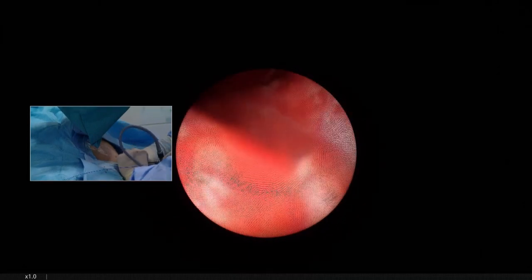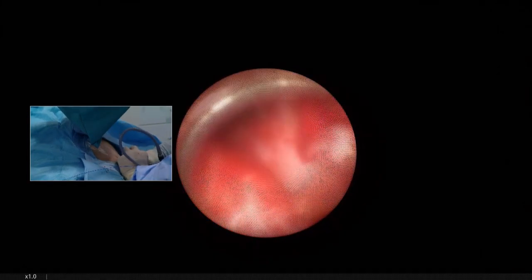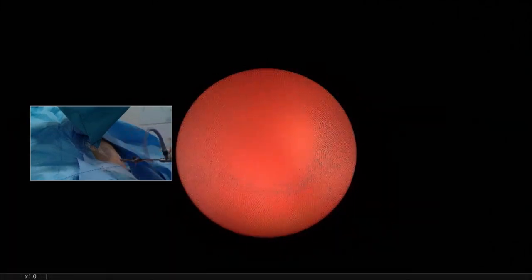Okay, then next we need contrast media. We are using some contrast dye.